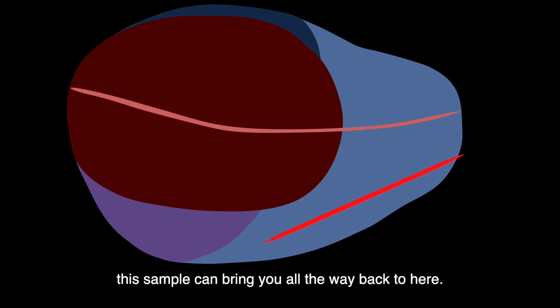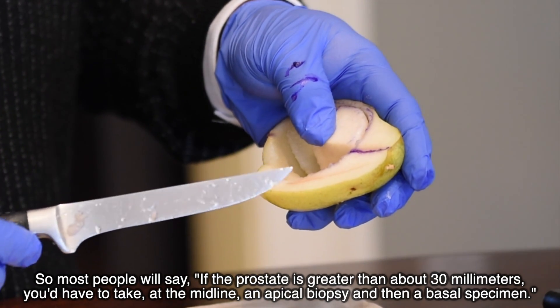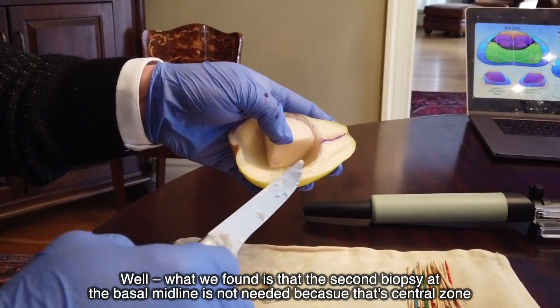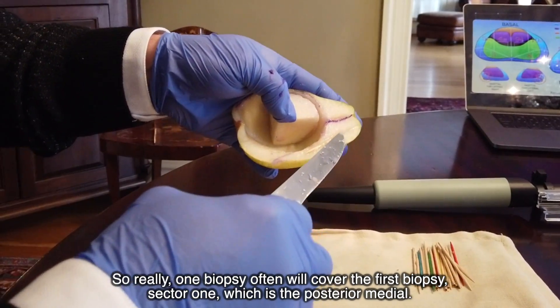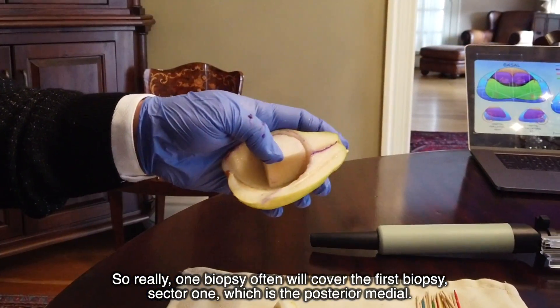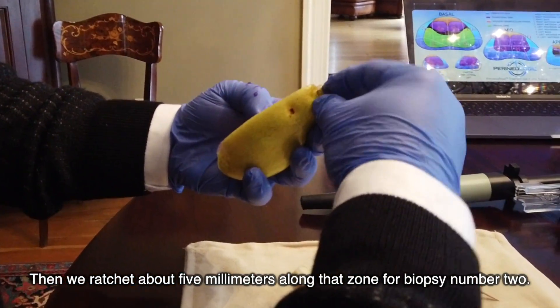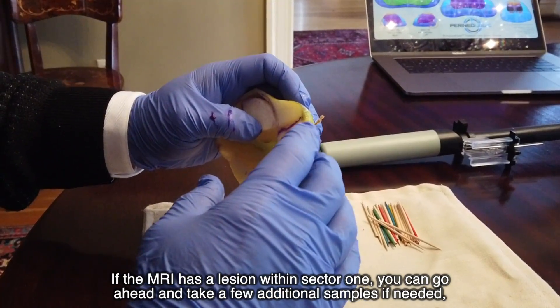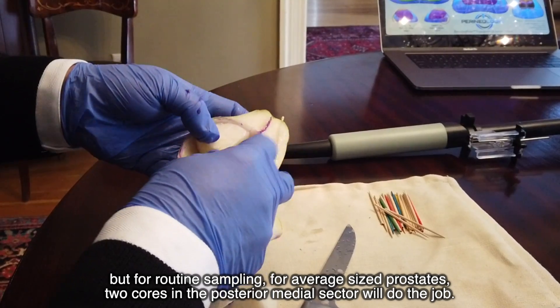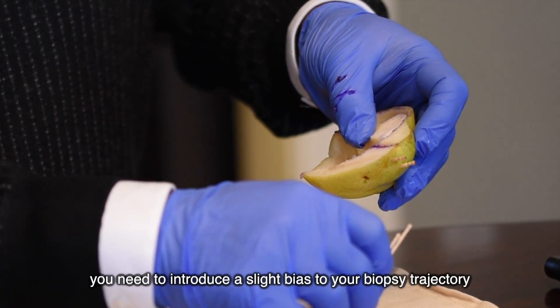Based on the 22-millimeter throw of your average biopsy needle, that core can bring you all the way back to the base. Most people say that if the prostate is greater than about 30 millimeters you'd need an apical biopsy and then a basal specimen at the midline — but we've found that the second basal midline biopsy isn't needed because that's central zone. So one biopsy often covers sector one. For routine sampling of average-size prostates, two cores in the posterior medial sector will do the job.